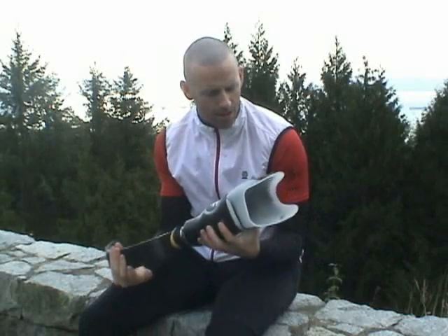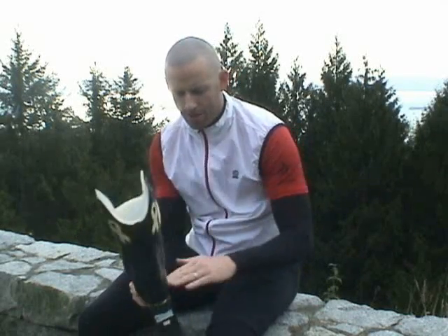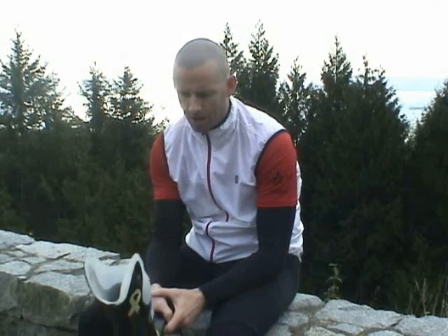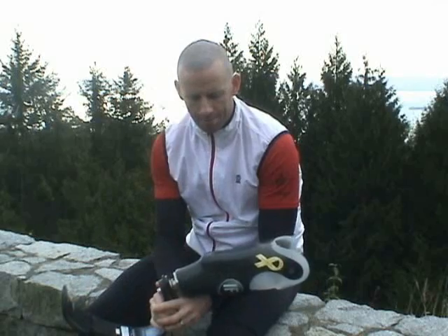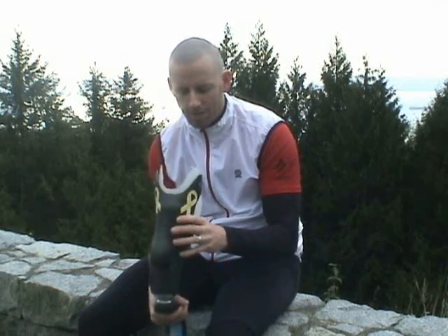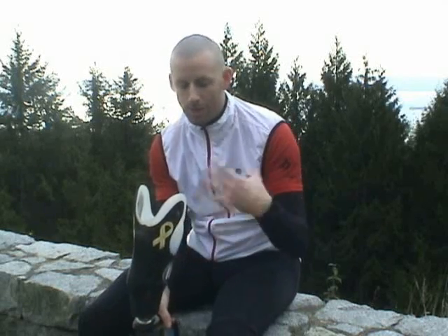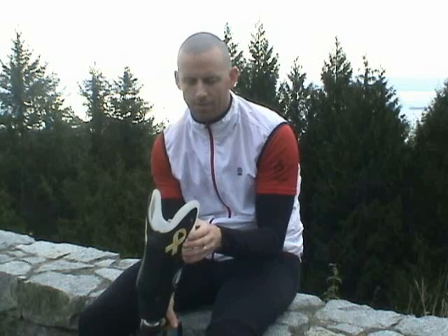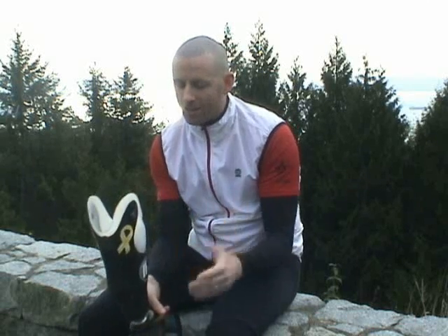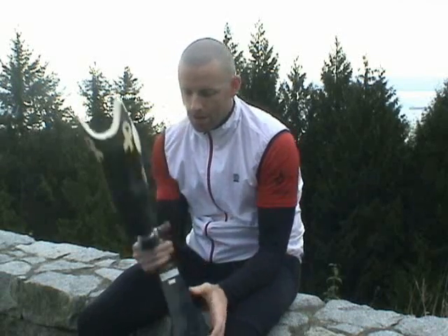Okay, so here's my running leg, and above the foot itself is a typical socket. I got him to leave it as light as possible and to cut away areas that we didn't think were going to be really necessary, to minimize the weight. Other than that, it's just a regular socket, same as any other socket.